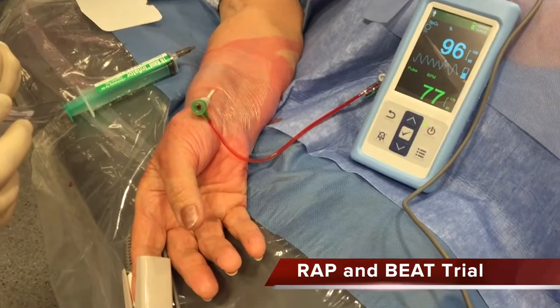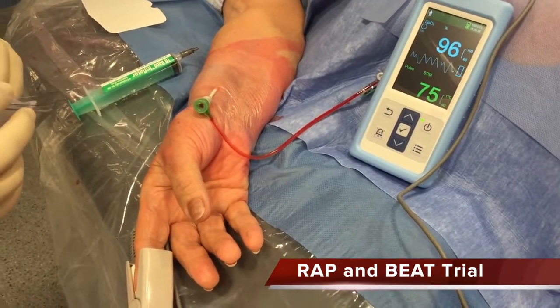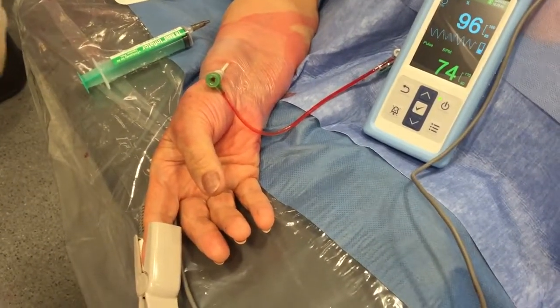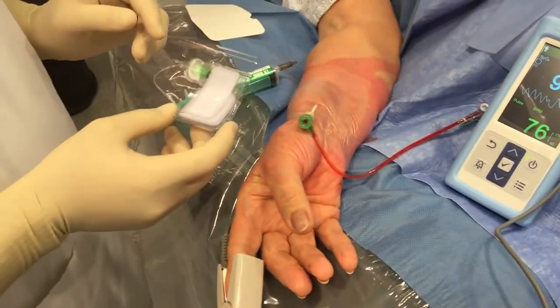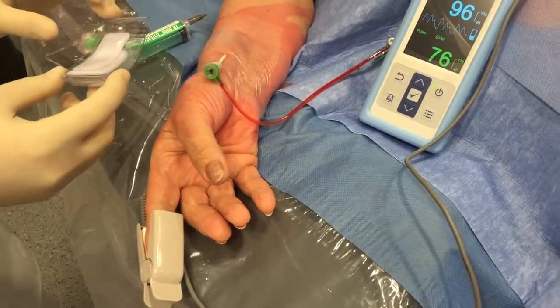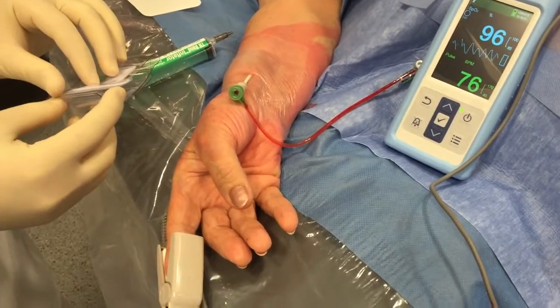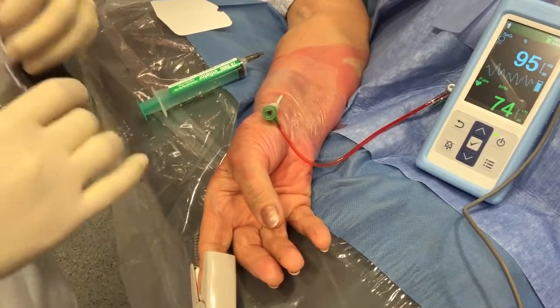This patient was randomized into the glide sheath slender six-French group, and now we are going to remove the introducer sheath. To perform a patent hemostasis protocol, you need a TR band, and you also need a plethysmograph with assessment of the arterial pulse, which is very important to assess the non-occlusive compression of the radial artery.